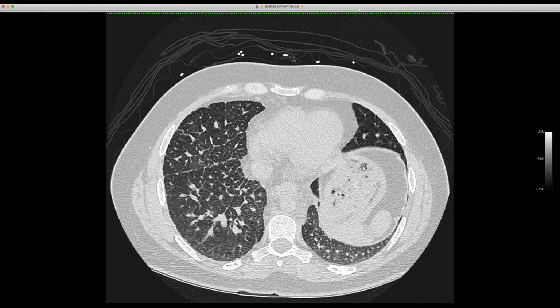You know, it's interesting because we were going back and forth over this with emails and whatnot, and there's some confusion in the literature. There's another entity called lymphangiomatosis, and a related syndrome called Gorham-Stout syndrome, where you get bone involvement. But that seems to be a different process. Those cases, and I know I have one from David and one from Seth, where there's sort of diffuse infiltration of the mediastinum and more perihilar disease. So I think there's some confusion in the literature out there, but I think this is lymphangiectasia.